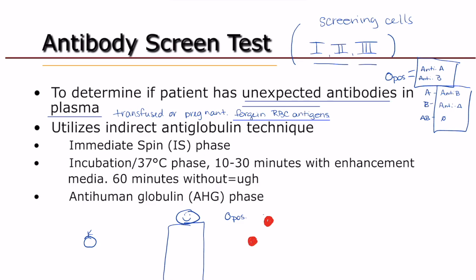Okay, and now over here, you have this red blood cell with a Kel on it, and I need blood. So you're going to give that to me. Now, once this red blood cell with this Kel on it is circulating with mine, the reason I'm being transfused is I don't have a lot of my happy little blank slates.